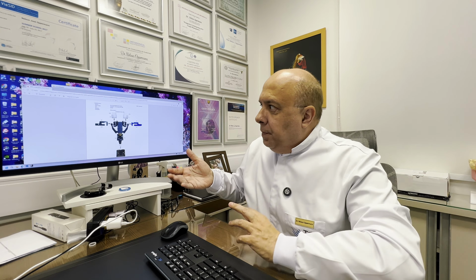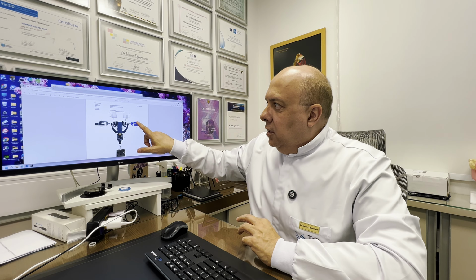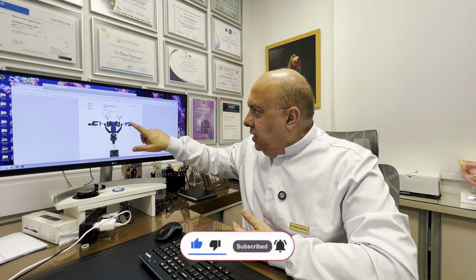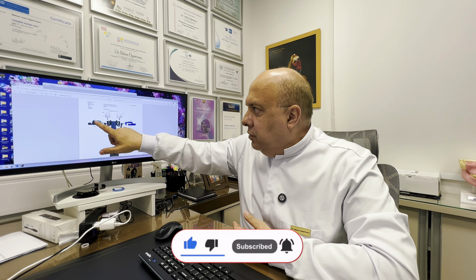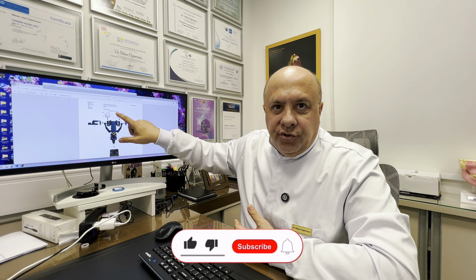And so this movement happens in a specific pathway, and the computer can calculate this angulation. For example, it gives me sagittal condylar curves of 39 on the left and 40 on the right, calculated for 3 millimeters of protrusion. Okay, if I want to move the mandible 3 millimeters forward, or within 3 millimeters, any sagittal movement that I want to do until 3 millimeters, this is the mounting that I have to do.